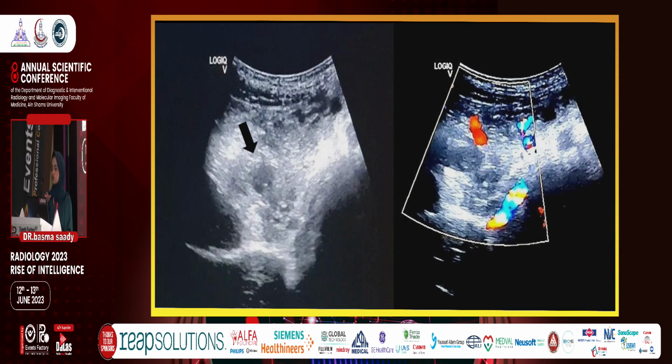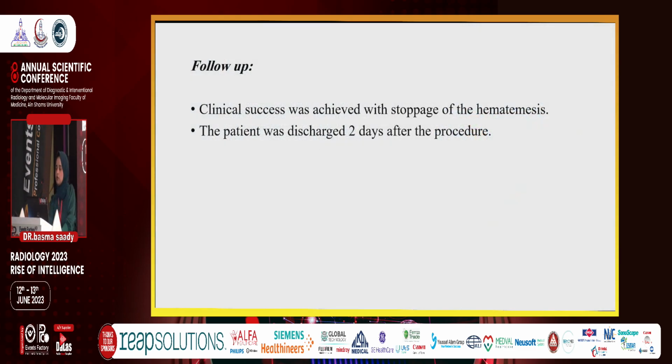We can see that there is no flow by the ultrasound in this vascular structure, which is the GDA, gastroduodenal artery aneurysm. In the follow-up of the patient, the hematemesis stopped, the patient improved, and he was discharged 2 days after the procedure.